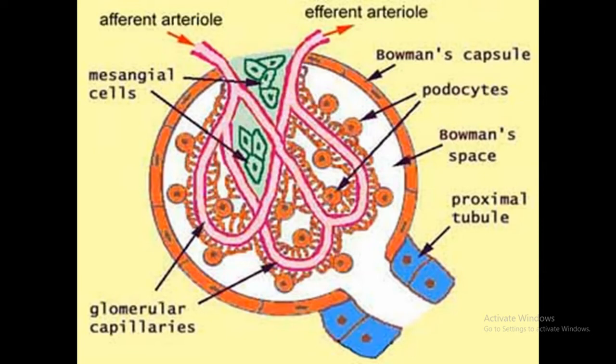As for immunofluorescence, it is a procedure that takes advantage of the antigen antibody reaction. When an antigen antibody reaction occurs, it can emit a green light when a special light, commonly UV light, is introduced. So when antigen antibody complexes are deposited in the glomeruli, they can emit a green light, so we use immunofluorescence to see this reaction.